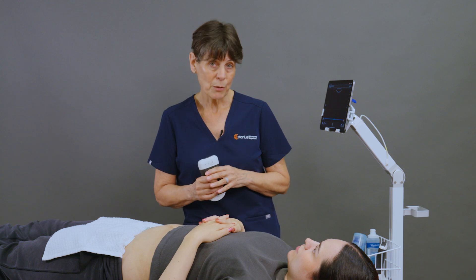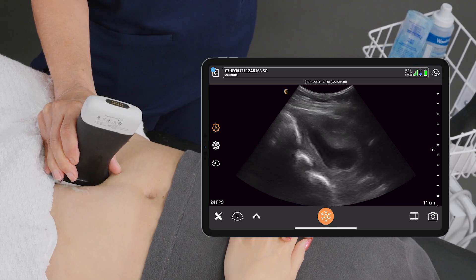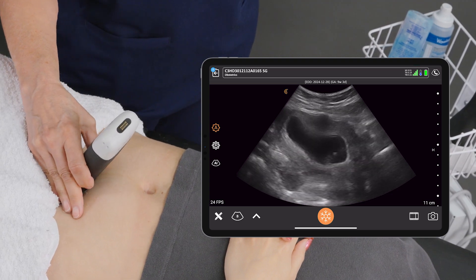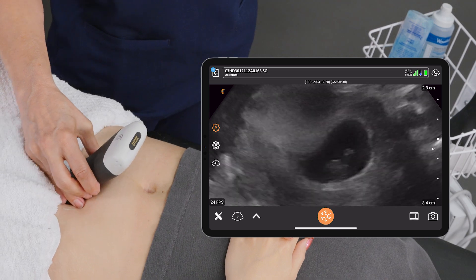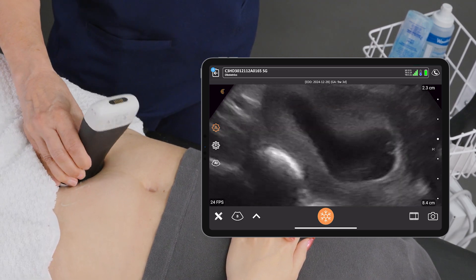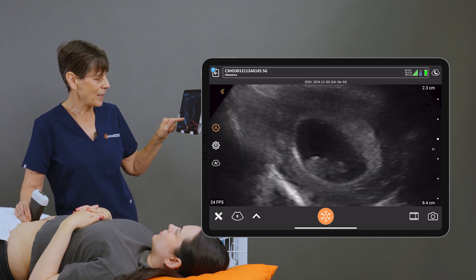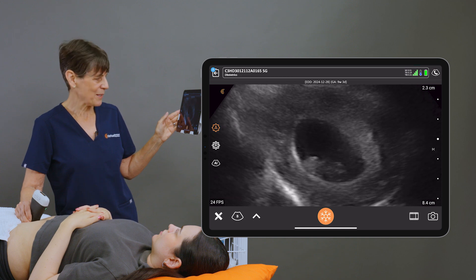In order to perform a crown rump length, we're going to place the scanner and locate our little fetus here. I'm going to pinch zoom the image and we're going to locate this little one — we can kind of make out a little head as well as the body, and we can see some motion and some heart motion as well.